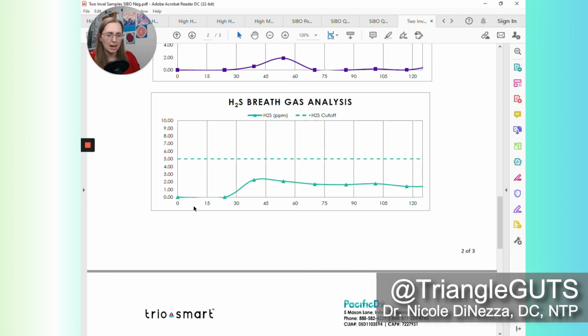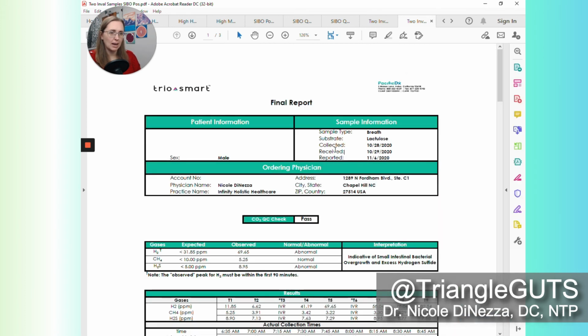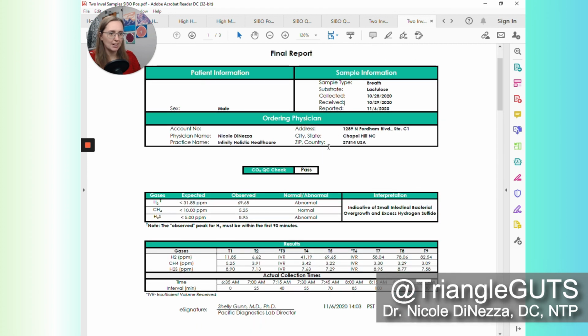But you've got to keep an eye out for those invalid samples. Those are really going to throw you for a loop. And sometimes, honestly, even for me, I'll take a glance and see something and think, oh man, that's SIBO. And then I have to take a double take and look at it again.